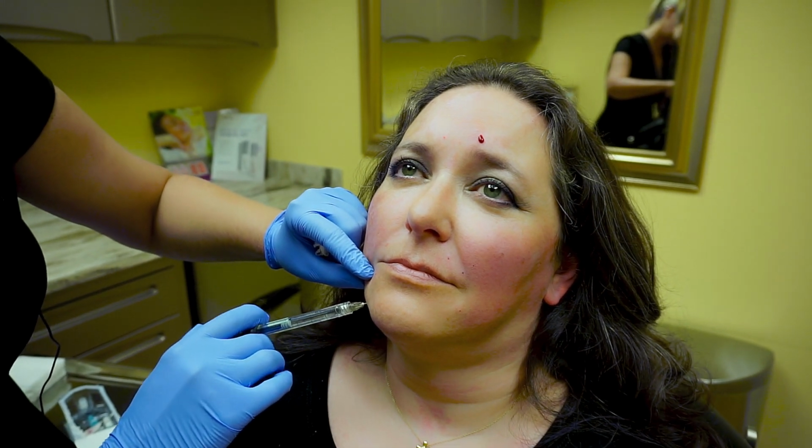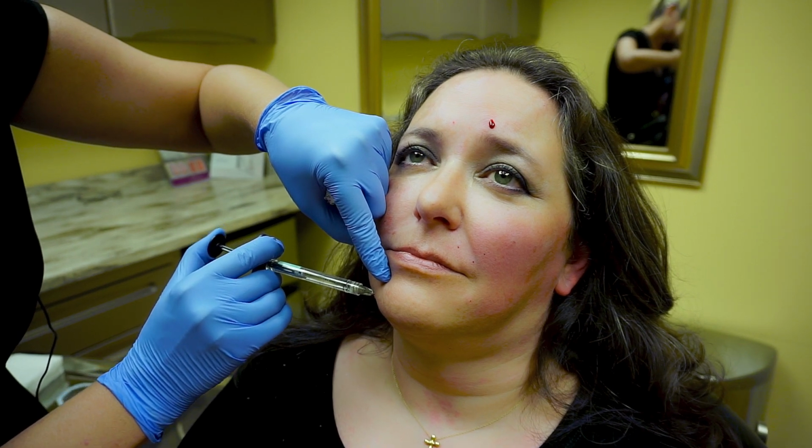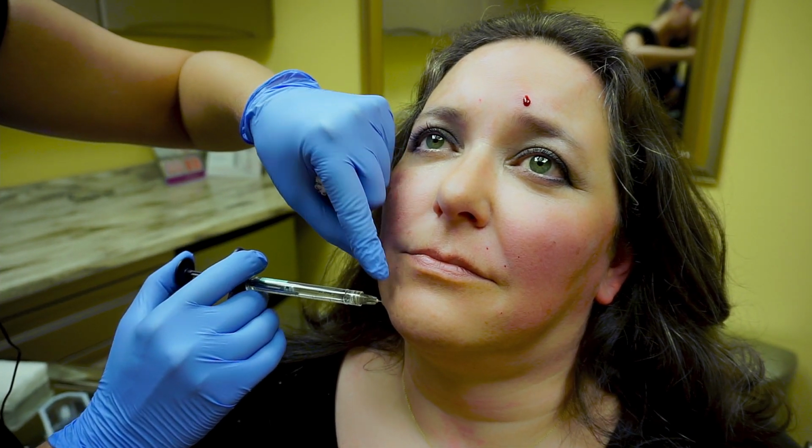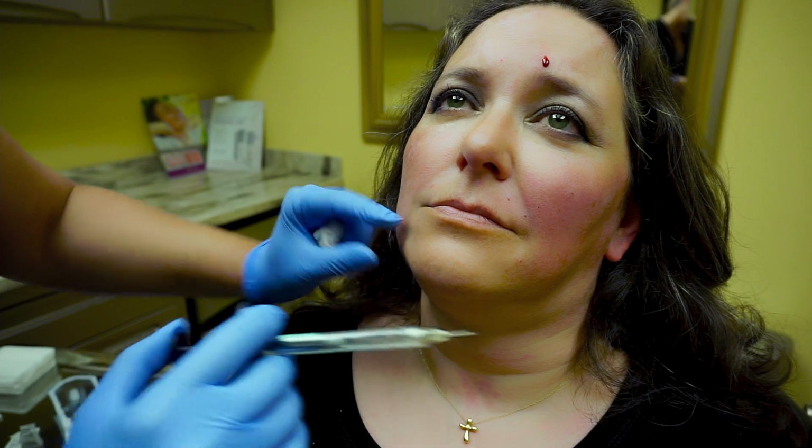So now I'm using a Restylane Define for the chin. And what I want to do is inject into the area in front of the jowl so that the effect of it is to even out so that you don't see it down, then up, then down. I want it just to go straight across. So I started building it up here in front. And now what I see is that just underneath here, I need to get some volume.